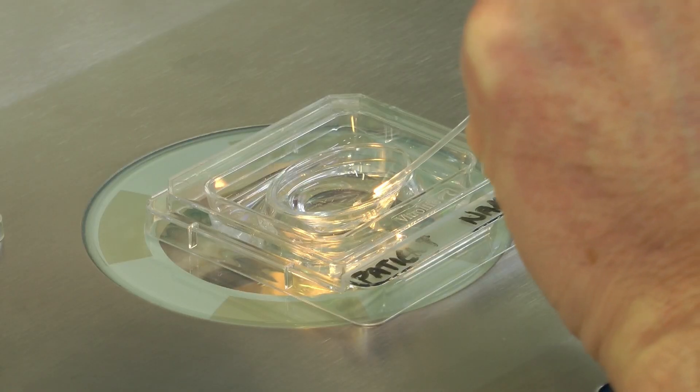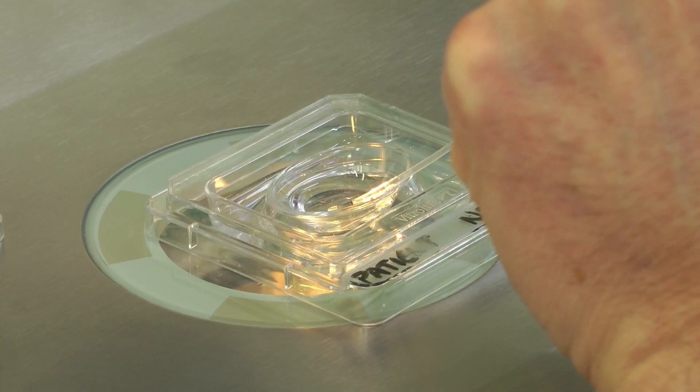After the Embryo Transfer, make a final examination of the catheter under the microscope to make sure the embryo was not retained.